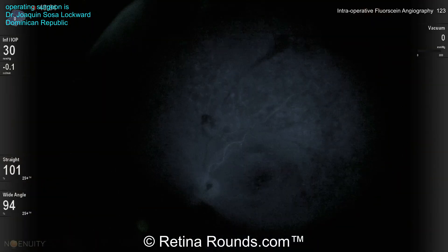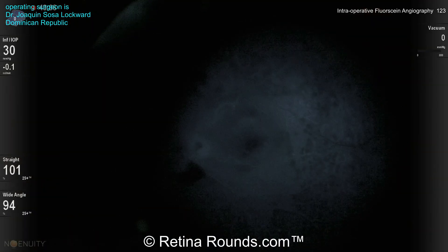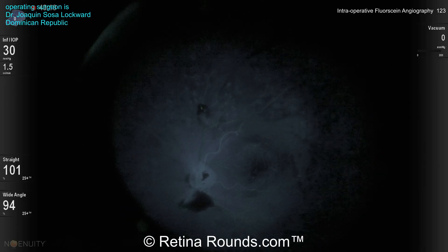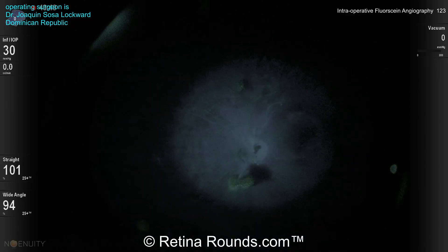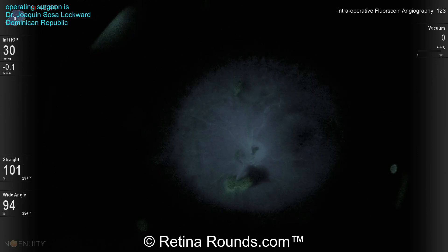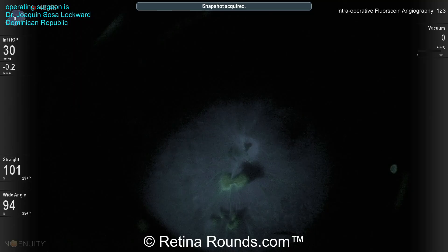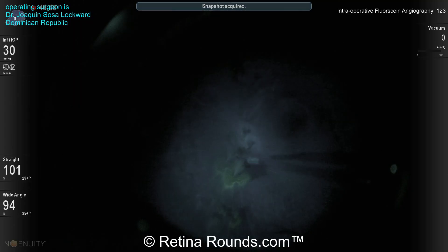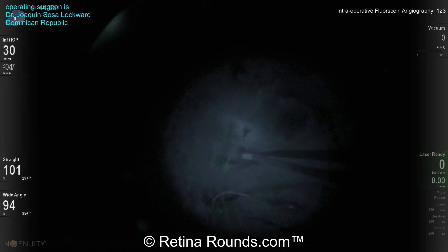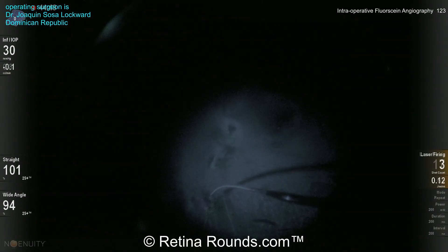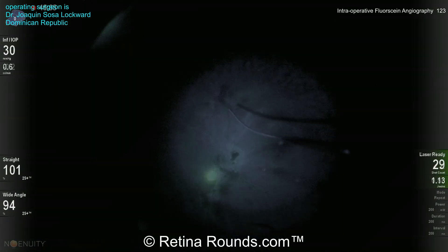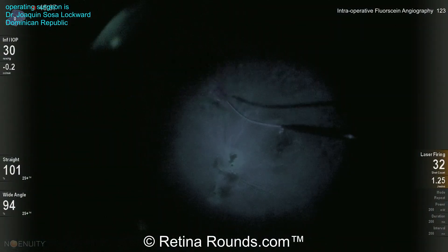Now he's switching to the intraoperative fluorescein angiography — at the end of the case, we'll go over more specifics as to how this is performed. But you can see that as the dye has been injected, there are some focal areas of leakage that can be identified — that's that green dye that's leaking. He's going to go ahead and use the photocoagulation probe to apply some laser to these areas, potentially to decrease the risk for postoperative hemorrhage.